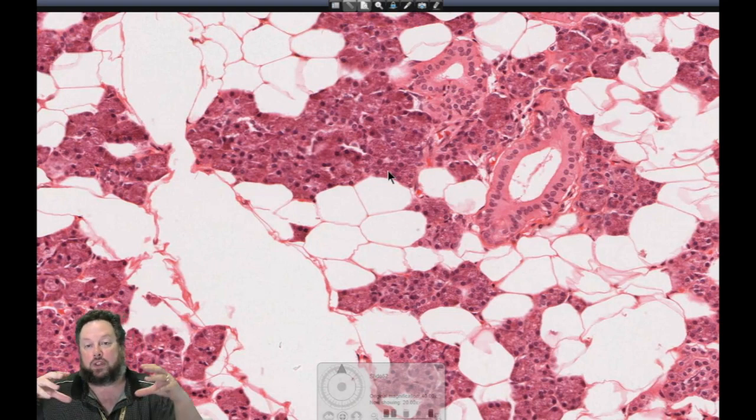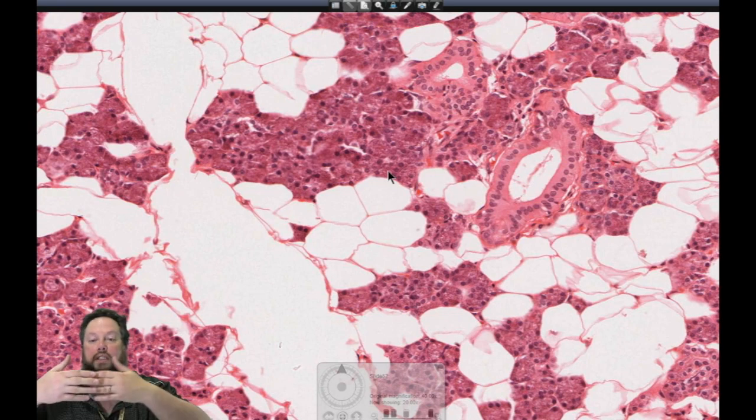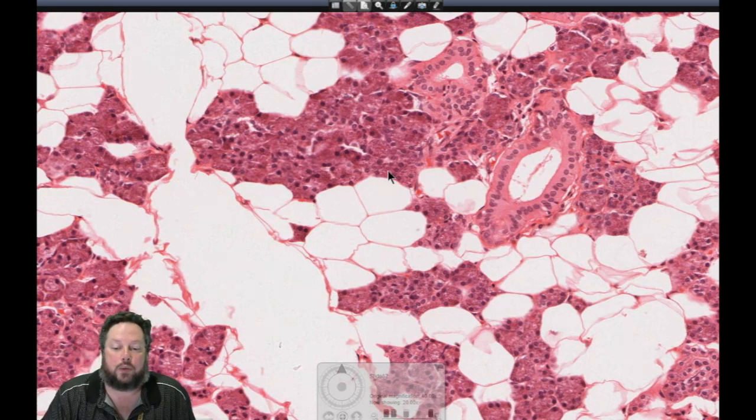At the base of the cell, we've got the round nucleus and lots of rough endoplasmic reticulum producing that protein, which is then processed by the Golgi and forms the secretory granules in the apical surface of the cell. Sometimes we can get a slightly different staining pattern, where the bottom of the cell is very basophilic, staining well with hematoxylin because of the high density of the nucleus and rough endoplasmic reticulum. And then the top of the cell can be quite acidophilic if it's storing those secretory granules containing the enzyme. But it's not always the way it works out, especially if the cells have secreted fairly recently, then you don't typically have that apical acidophilia.